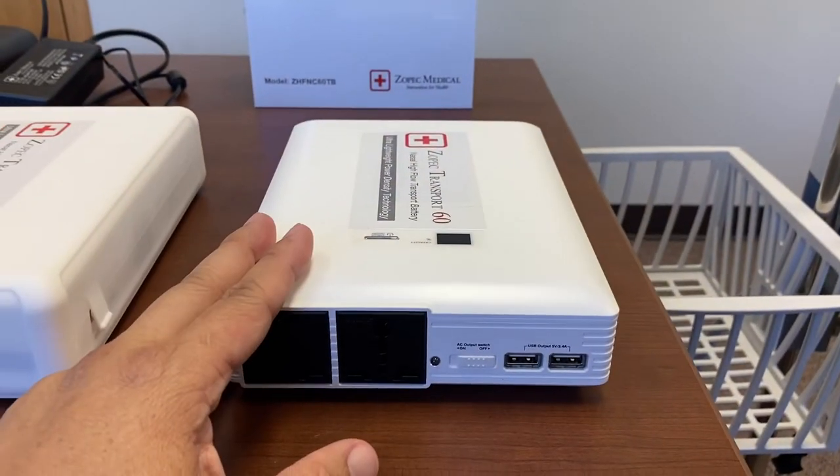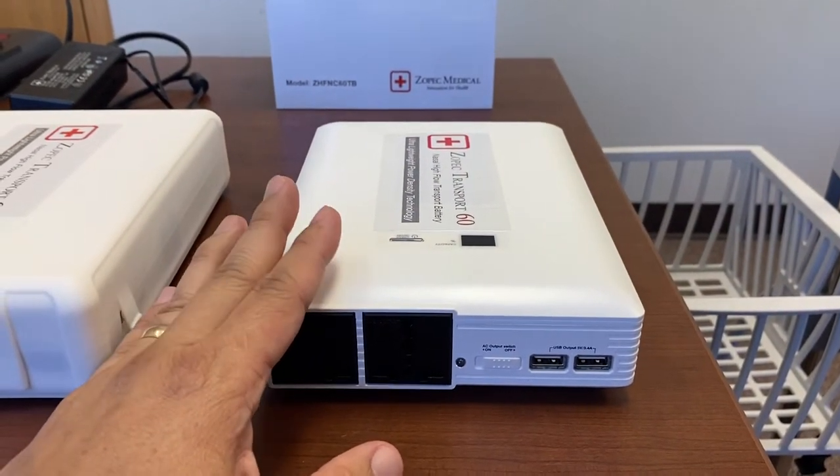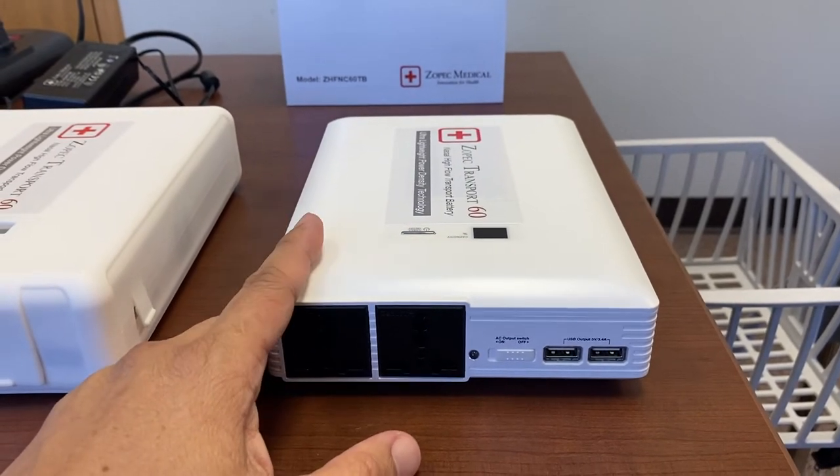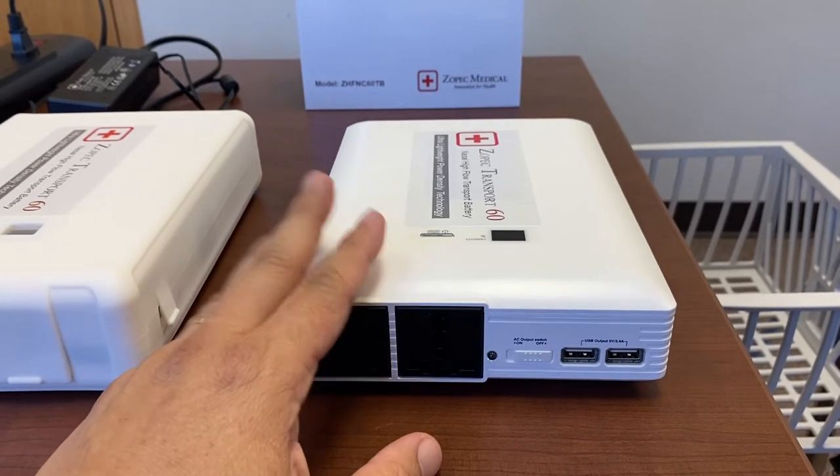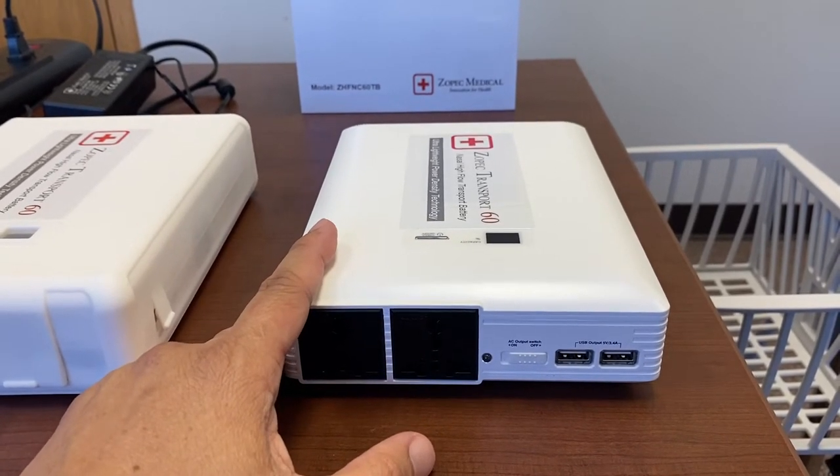In the transport series we have the 60 as well as longer transport times if interested, but this is the only one that's FAA compliant for air transport.